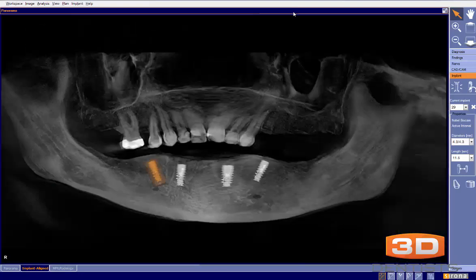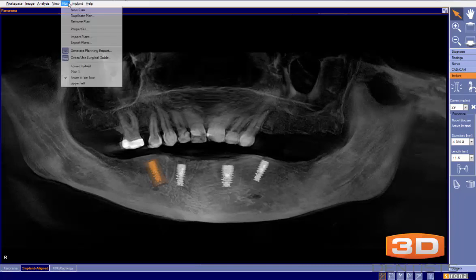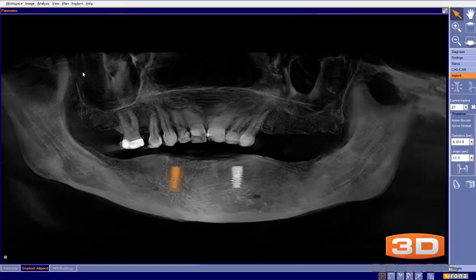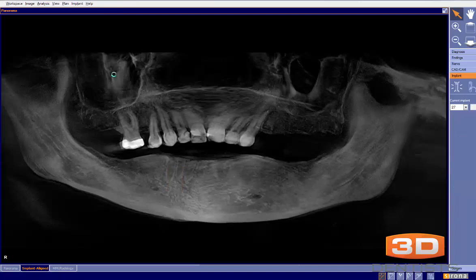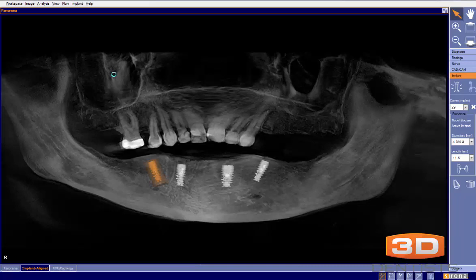Whether that's perfectly accurate isn't the point right now. I can go back here and switch between the two plans and say: 'Mrs. Jones, one option is a lower overdenture, or we can consider a fixed hybrid.' We're able to switch back and forth, and we also have legal documentation of the various plans we put together.